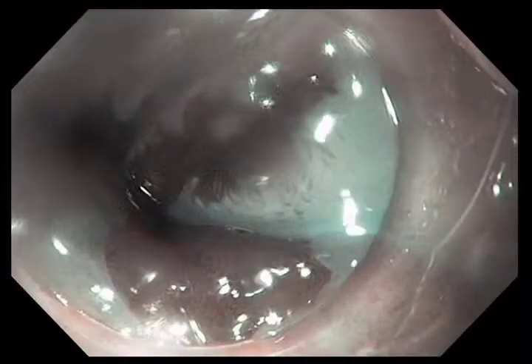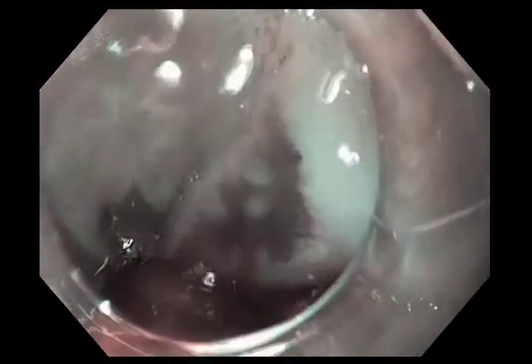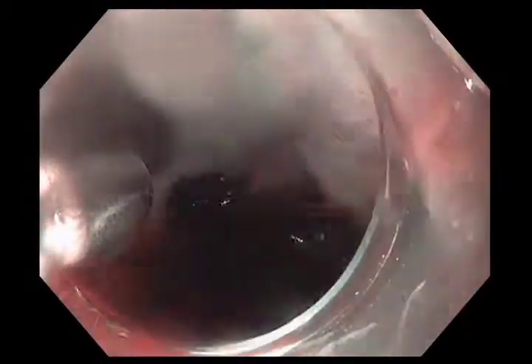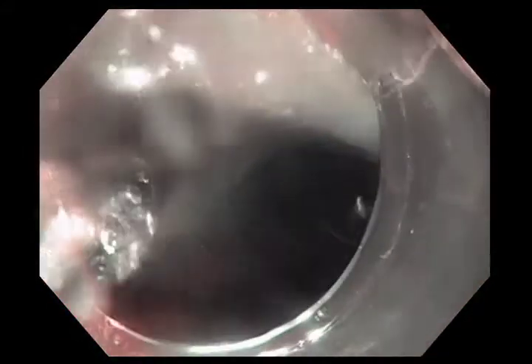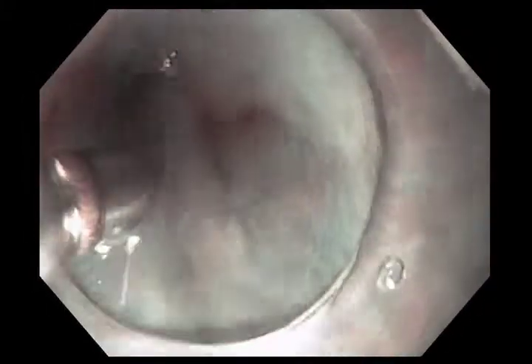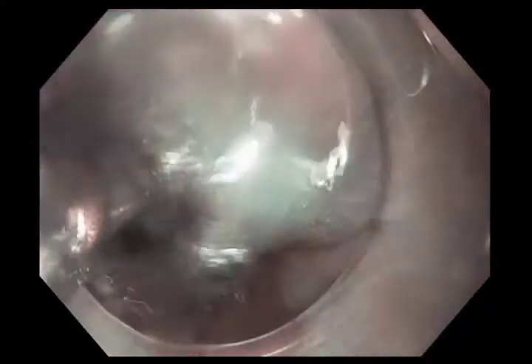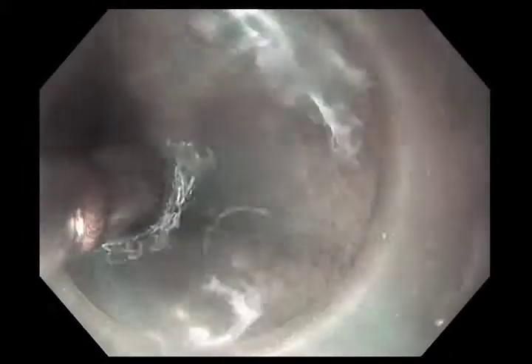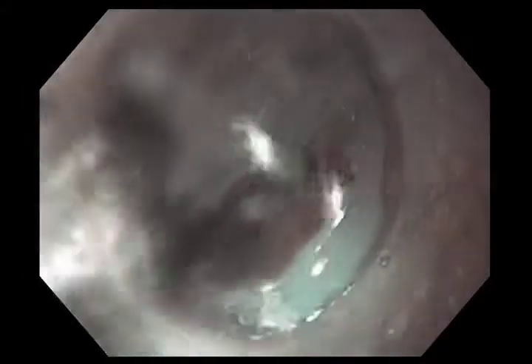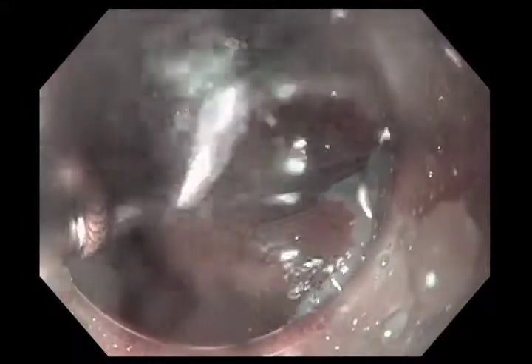The first thing we do is actually wash the Barrett's epithelium. You can see a washing catheter being delivered through the biopsy channel. We're washing with a material called mucomyst, which is a mucolytic agent. Columnar and Barrett's epithelium produces mucus, and we want optimal contact between the radiofrequency ablation device and the mucosa. To do so, we want to get rid of the mucus by spraying mucomyst on it.